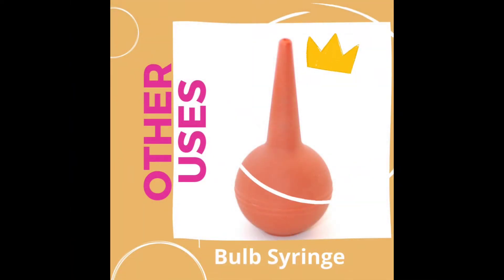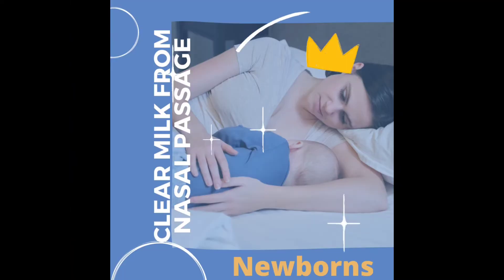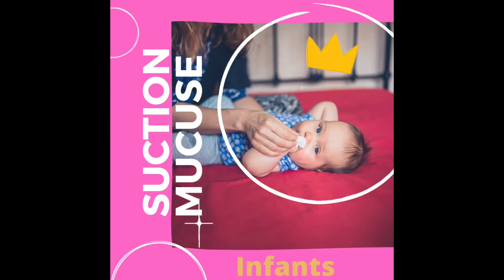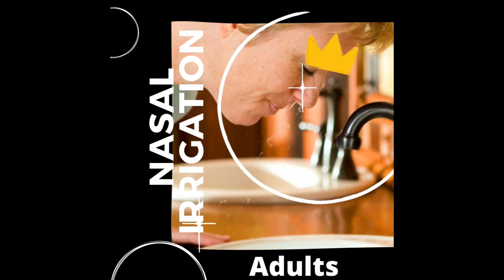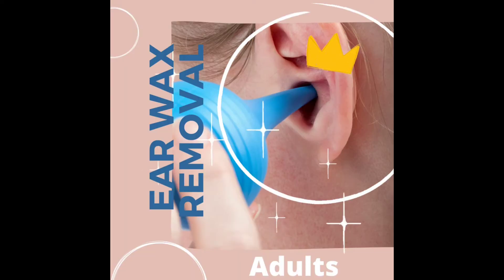Other uses of the bulb syringe: clear milk from the nasal passage in newborns; suction mucus in infants; remove foreign objects in toddlers; nasal irrigation in adults; and earwax removal in adults.